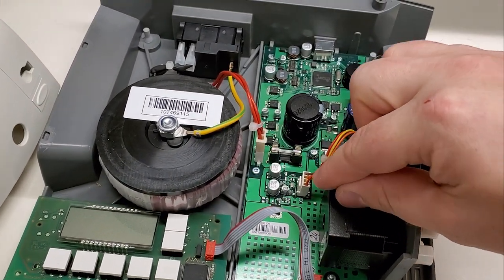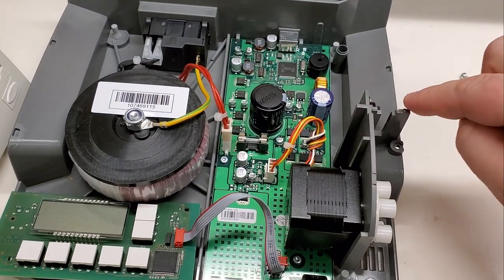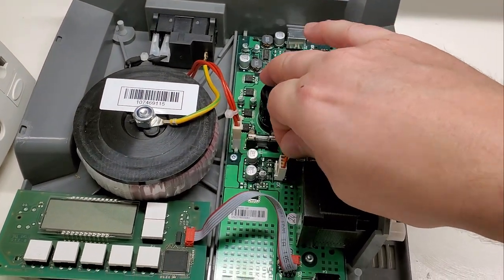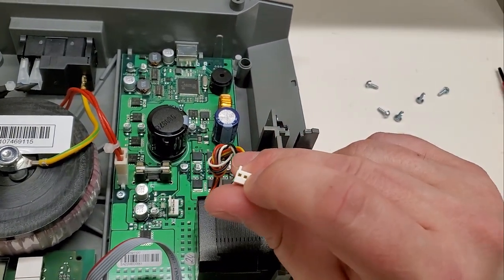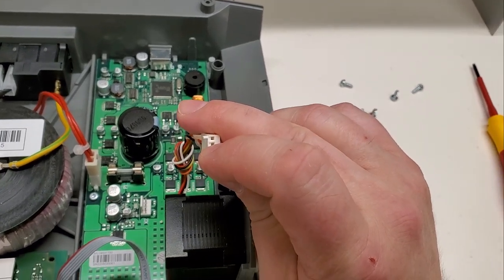You could test the outcoming pulses with an oscilloscope and you would see your square wave. Or you could test the motor by disconnecting this wire right here and you short out two of these, which would be your one coil, and then the other two you can short out separately.